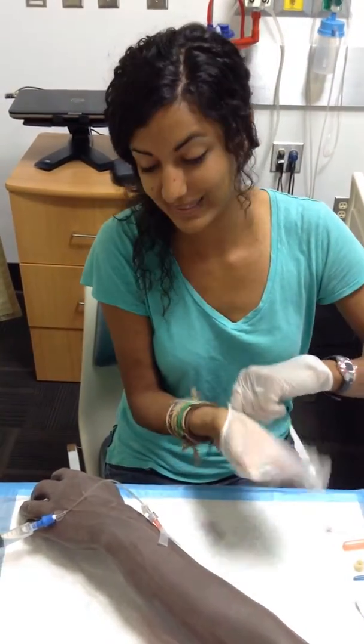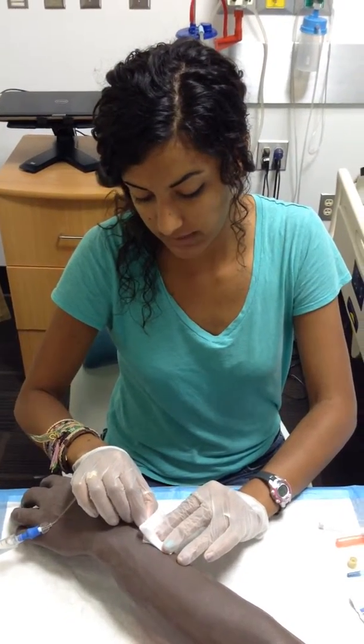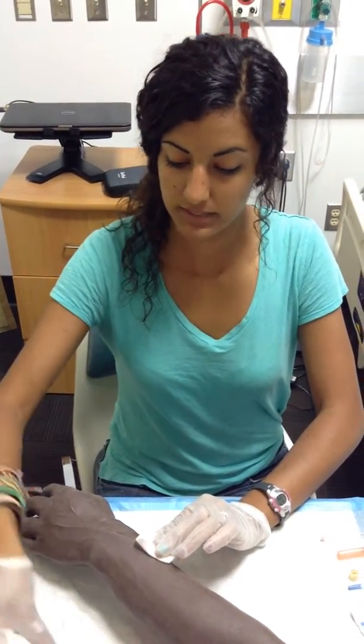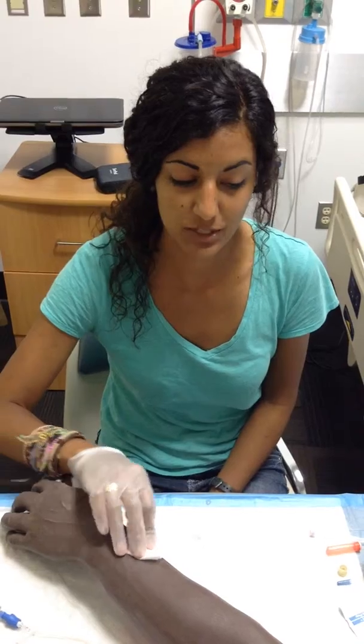And with a clean 2x2 gauze, I'll apply light pressure on the site and then remove in the same direction that it was inserted. And I will inspect the catheter for intactness. Looks good to me. I'll apply light pressure for 2 to 3 minutes and then apply a Band-Aid, and the patient should be good to go.